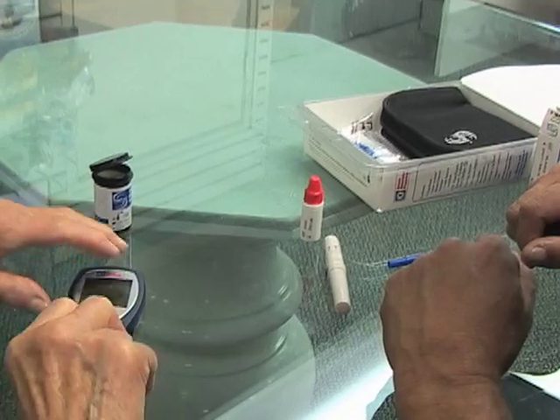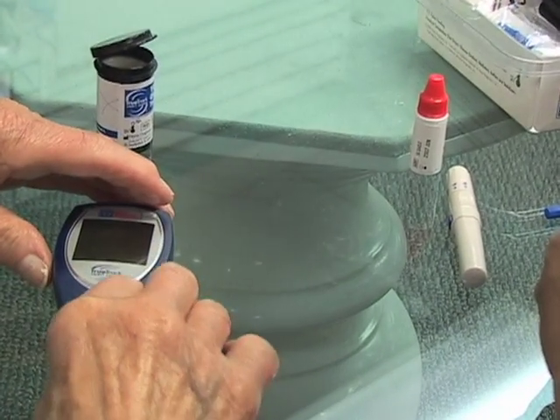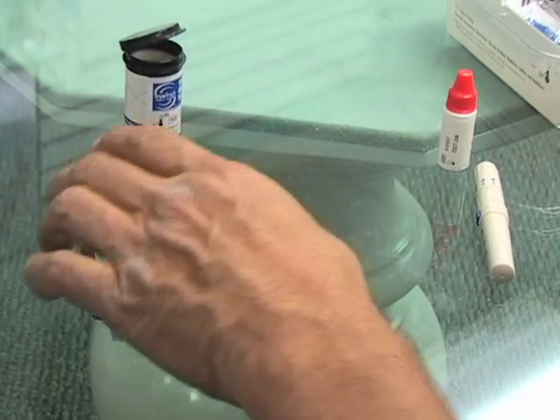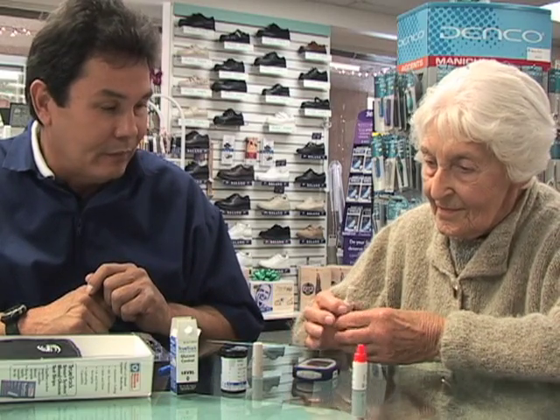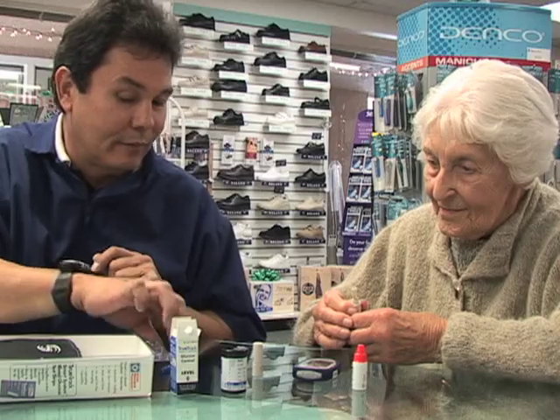Now Joe is ready for Mrs. Nelson to perform a return demonstration. If she makes mistakes or is unsure, Joe repeats the instruction and reviews them with her until she feels comfortable enough to try again.